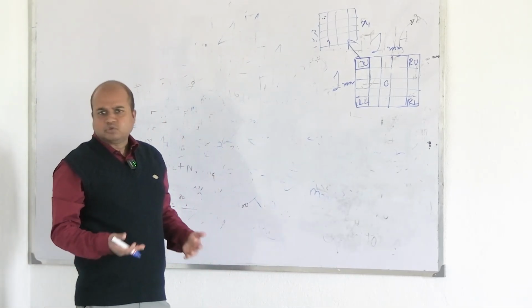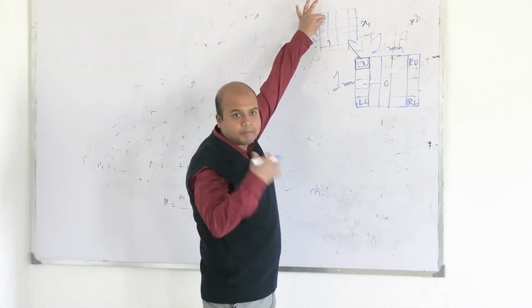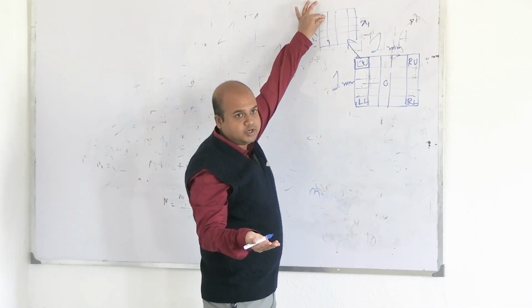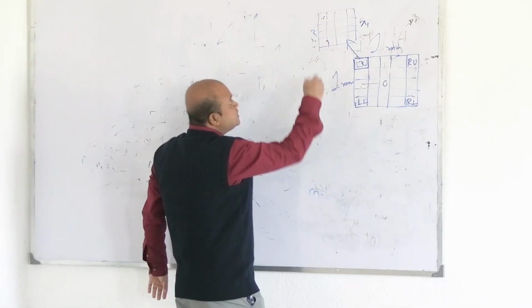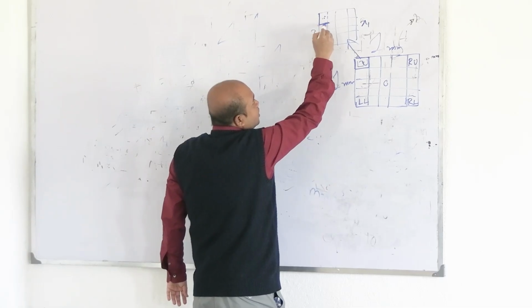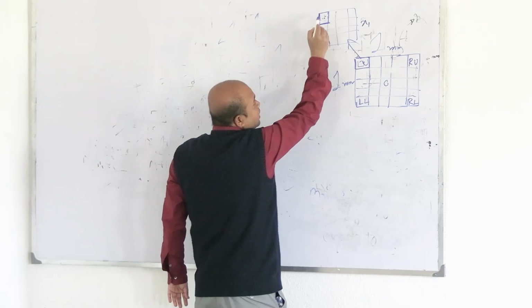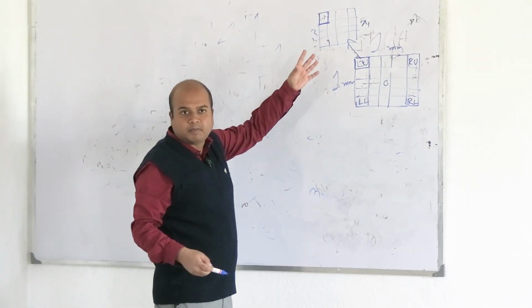In case of WBCs also, cells won't be lying only inside the squares. Squares are made for our convenience, the human eyes' convenience. So, cells will lie on the margins also. The number of cells is so many in case of RBCs. Cells will lie inside a square, small square, medium square, whatever, and also on margins.